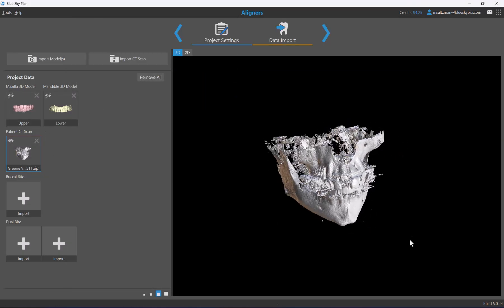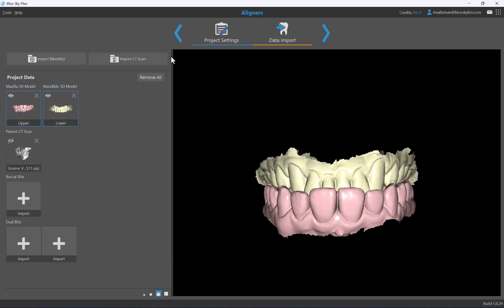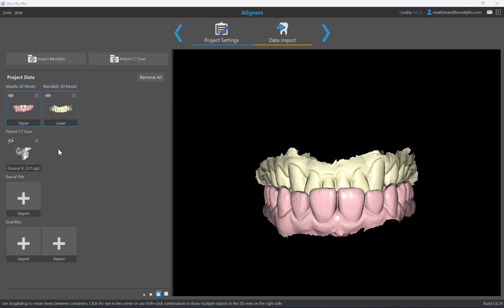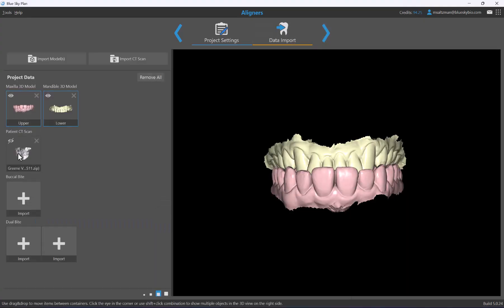Once you add the CT scan, the software's flow changes to take into consideration the CT scan, segmentation of the teeth, and alignment of the segmented CT teeth and CT bone with the imported models. You can toggle visibility options on and off. To remove a model or CT scan, click the red X; to remove all, click remove all. If you selected the wrong jaw, click back to correct it and your data import selection will remain on screen. Clicking next will load the data and proceed with the case.